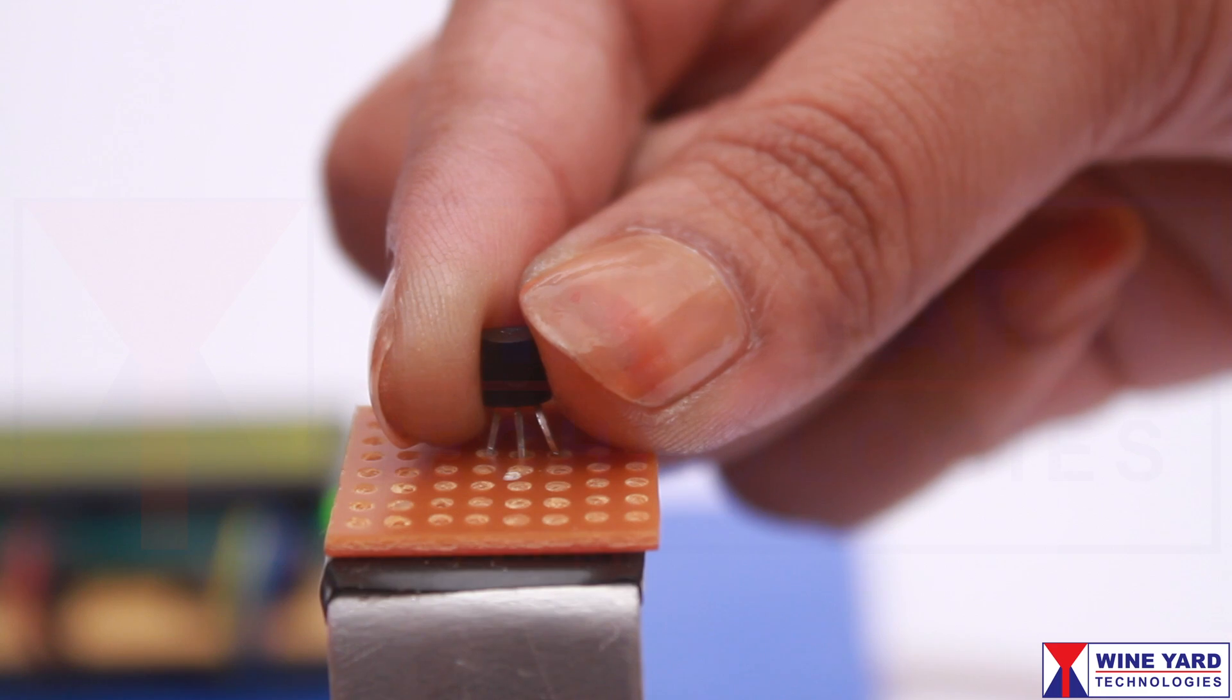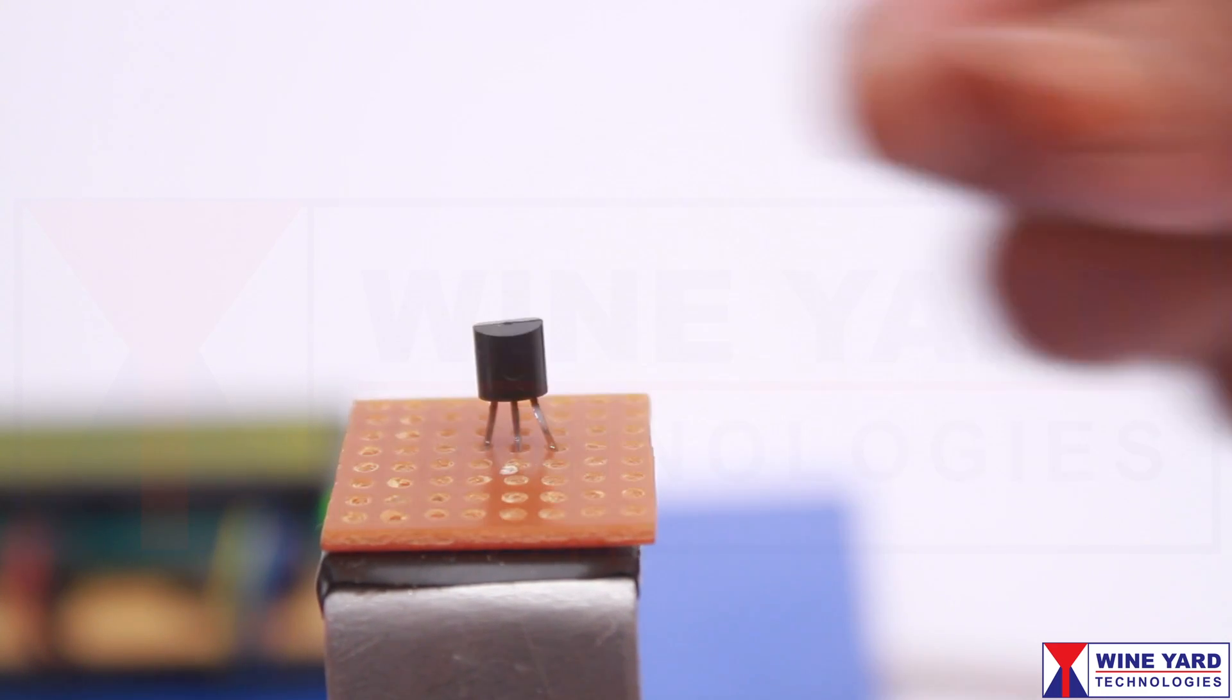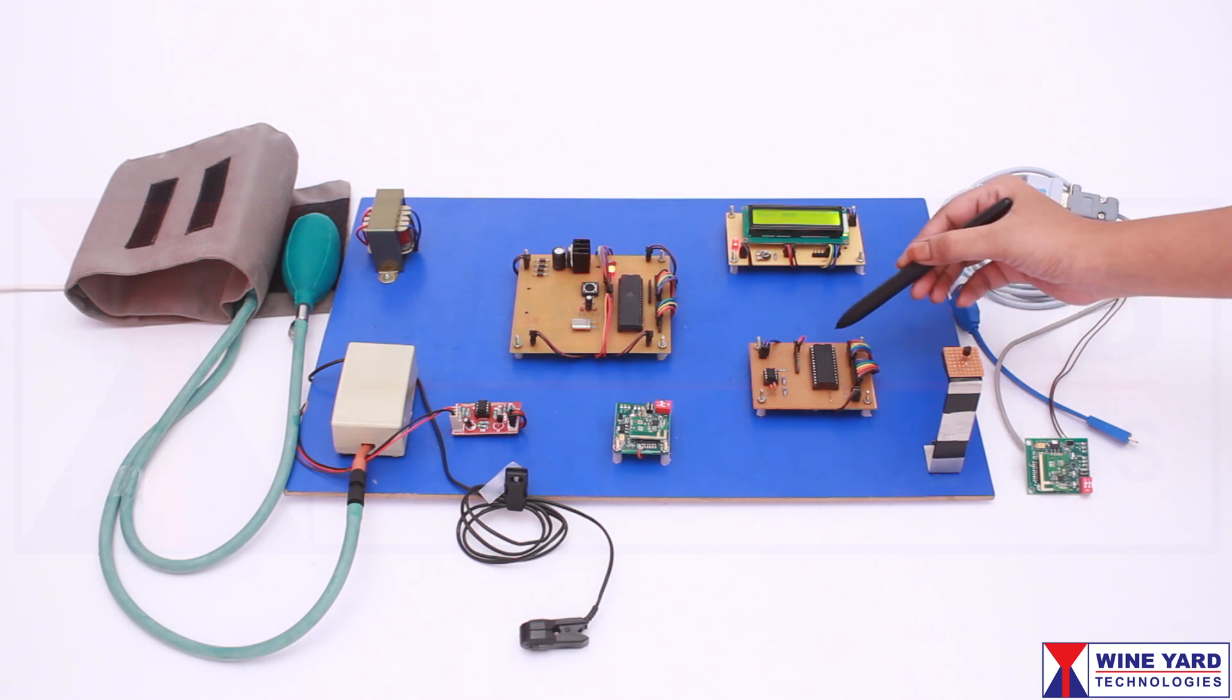This sensor measures the body temperature and communicates to the microcontroller through this ADC.